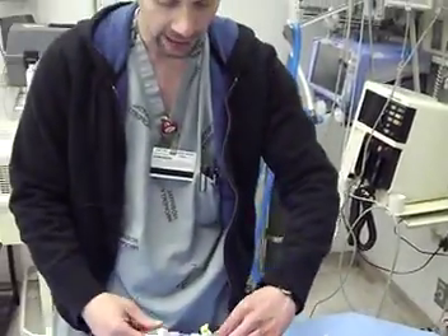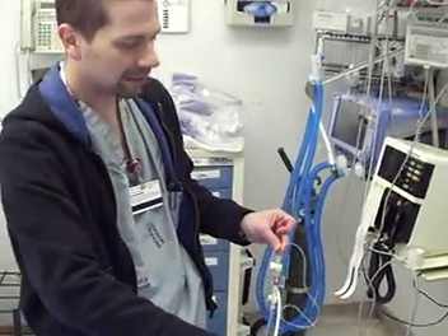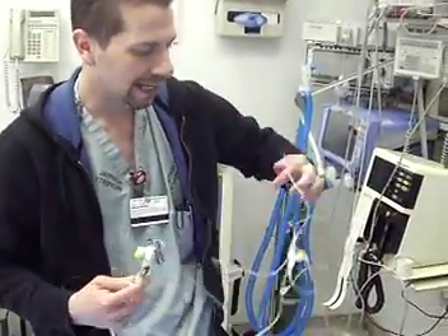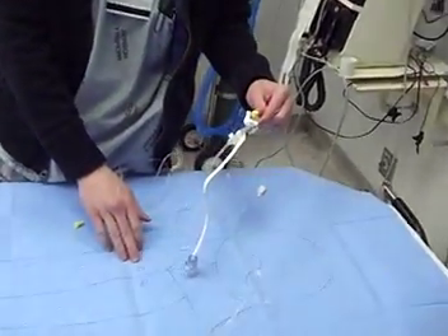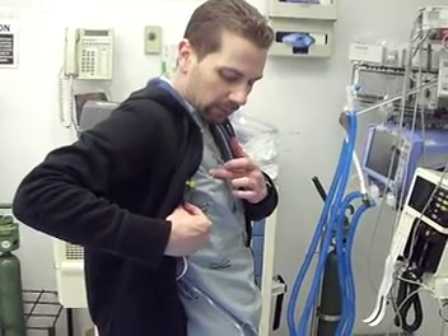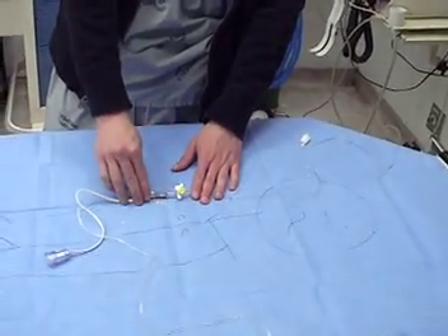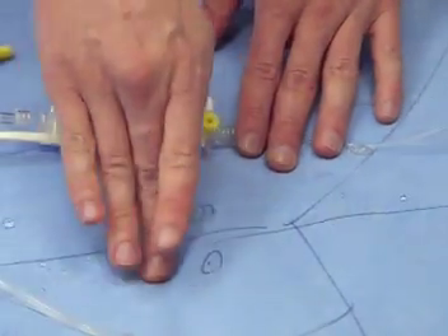What you're going to do first is position this pressure transducer on the patient themselves — and that's the way we do it in the emergency department. You've seen folks hanging them at the bedside with a little clip that they would then level to the patient, but our patients are moving around too much for that to work. So what we do instead is we tape this to the patient's phlebostatic axis. The phlebostatic axis is the mid-axillary line at the fourth intercostal space, which is right around the nipple line in most patients. What actually has to be at that level is this stopcock port — that's what you're looking for to get taped at the fourth intercostal space mid-axillary line.